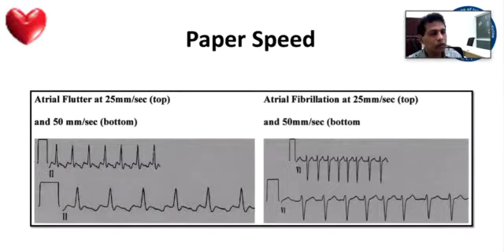And also the second panel, you know when you see that this is atrial fibrillation because it is irregularly irregular, and not only the rhythm, even the QRS complexes are irregularly recorded. However, the same ECGs have been taken by making the paper speed faster, so 50 millimeters per second. And you see that the characteristic rhythm pattern that we recognize has been lost.